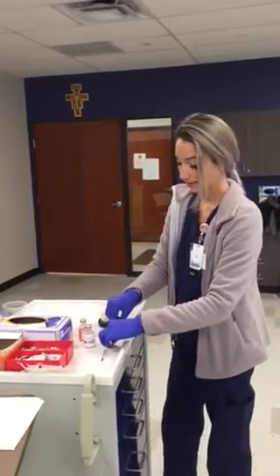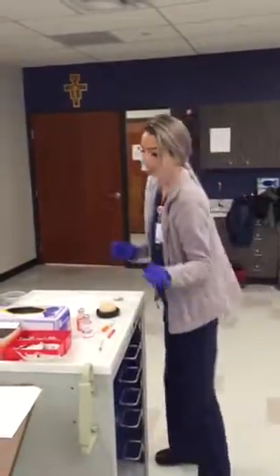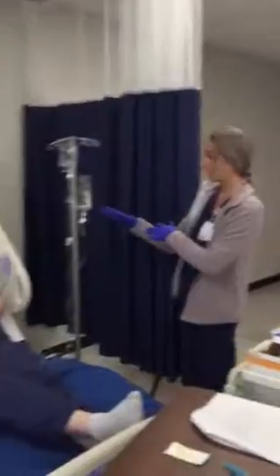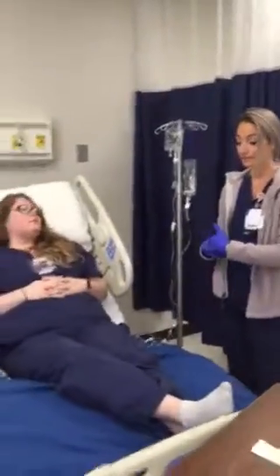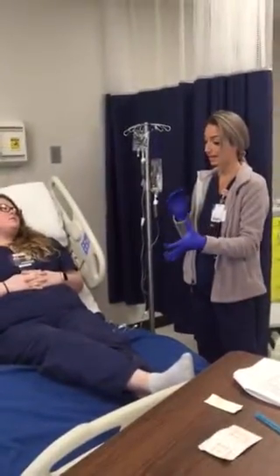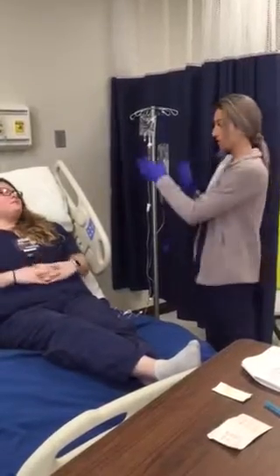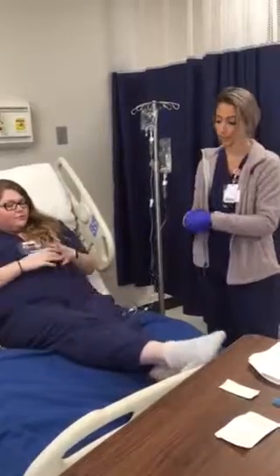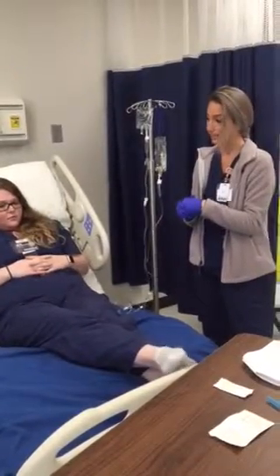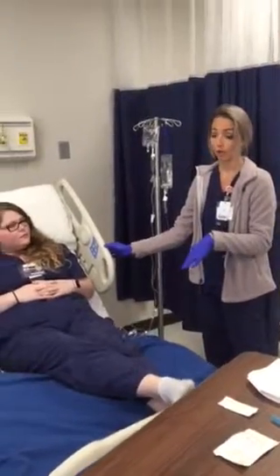Again, kind of swooping all the needles back in. I would dispose of them. She's already gotten her IV piggyback, her by-mouth medicines, her injections. I'm going to sit with her, the adverse effects, making sure that nothing's interacting, again, assessing for any allergies since she's on antibiotics, heparin, watching her blood pressure with these medicines, and then I'm going to lower the bed back down, make sure her call light's here.